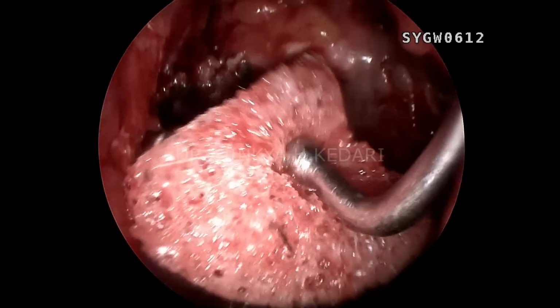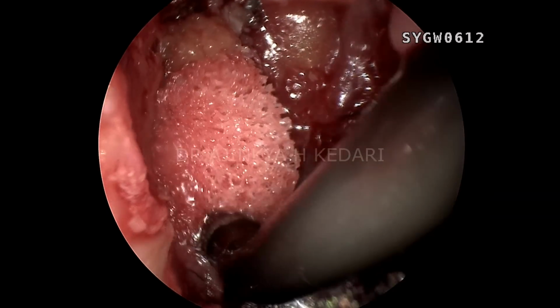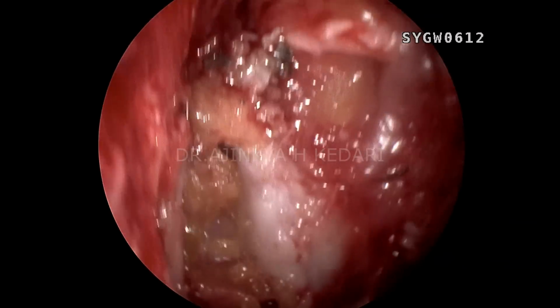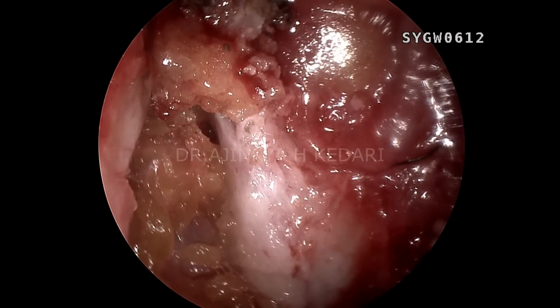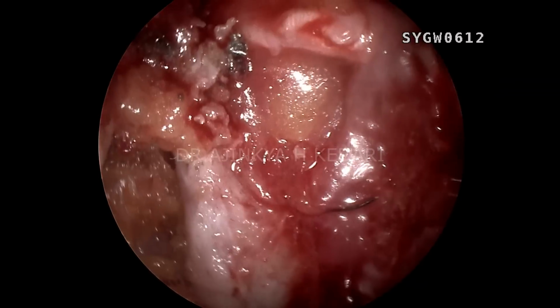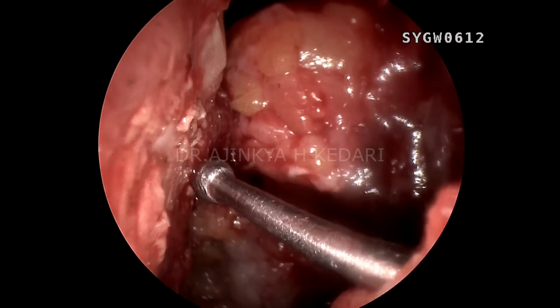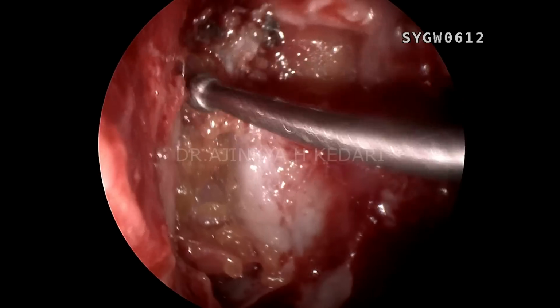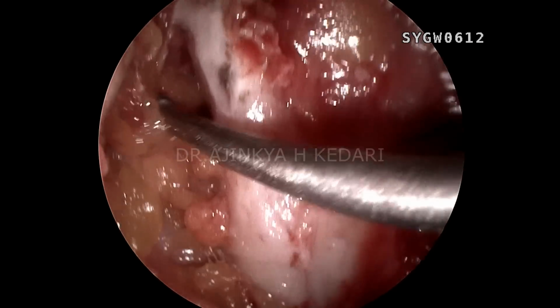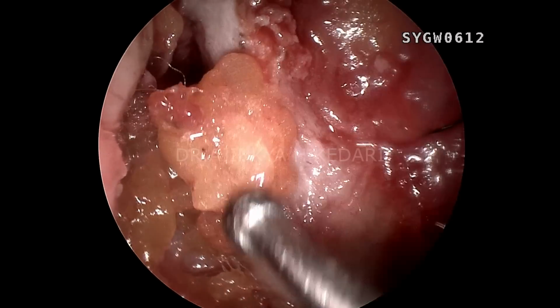You can see I'm using a neuro patty just to keep pressure on the fat and suction at the same time, so that the fat does not get sucked up in the suction machine. You can see that's the fat. I'm going to put one more layer of fat, completely plug that area, and as you can see, I've completely taken away the mucosa from that skull base area so as to not form any kind of mucocele or entrapment of secretions. The bone is raw. You can see that's all skull base, that's all brain above.